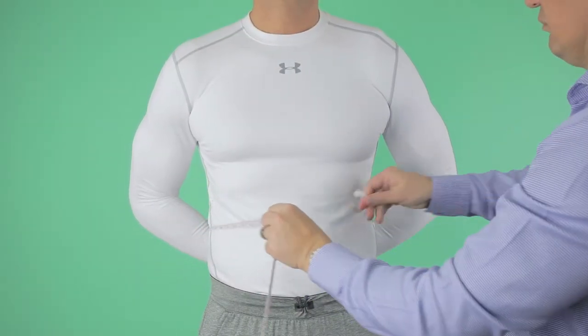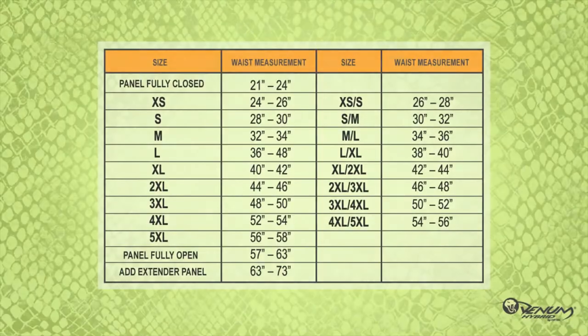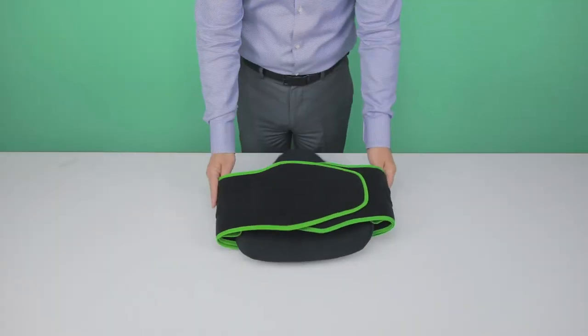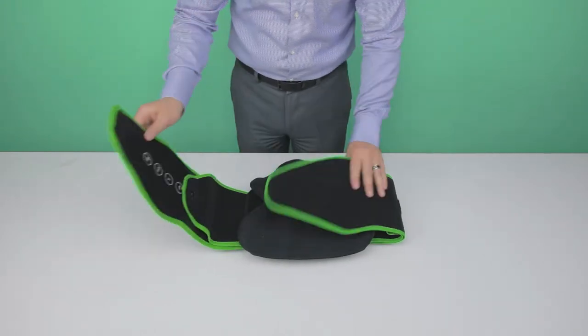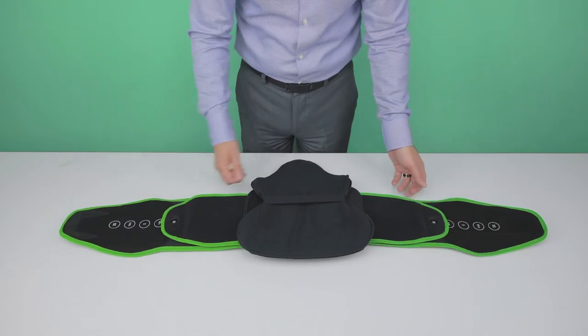To size the brace correctly, first measure the patient circumference around the waist. Using the sizing chart, determine the appropriate setting. The Venom Hybrid Braces come preset to medium size. If a size other than medium is required, follow these steps.